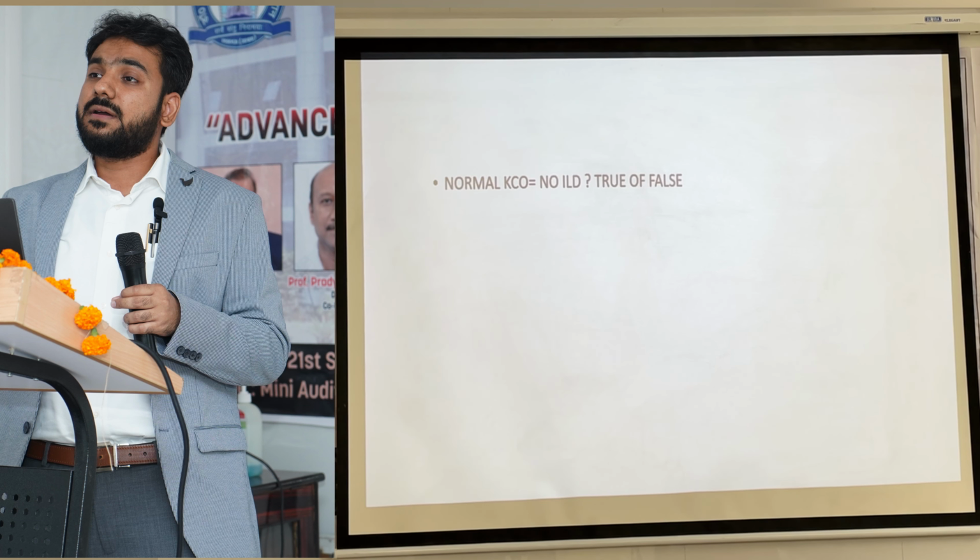So in patients with advanced ILD whose lung volumes are very small, their KCO might be normal, because some parts of the alveolar capillary membrane are destroyed and not taking part in diffusion, but whatever is left shows the efficiency of that part. So in cases of severe ILD, we might see a patient with normal KCO. That is because the VA was reduced and it has led to a curvilinear or exponential rise in KCO.